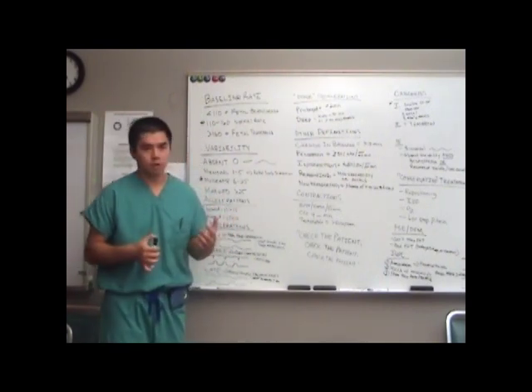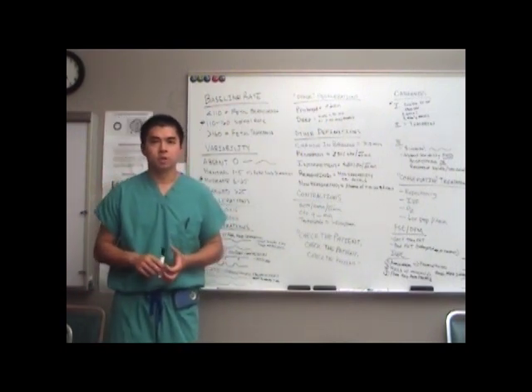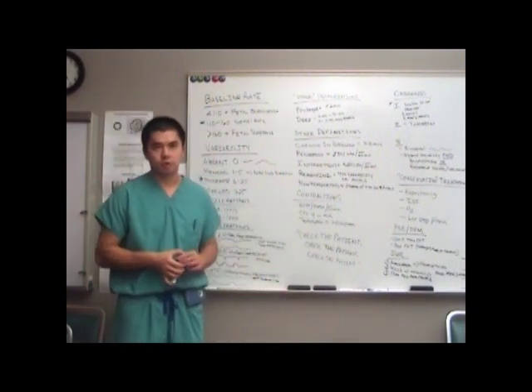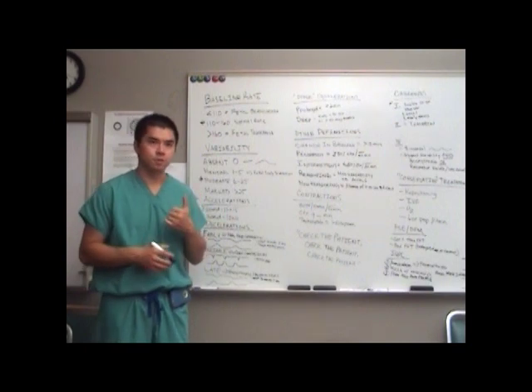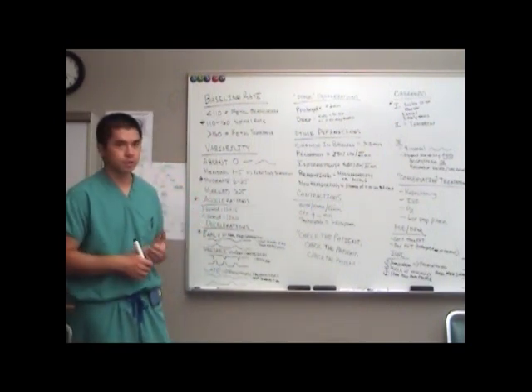It's also important to know how to describe fetal heart tracings to your listeners, and you want to give them an exact definition and err on the side of being more descriptive rather than going to categories, because your goal as the person describing the fetal heart tracing is to be able to describe it in a way that your listener can reproduce the exact image in their mind of what you're seeing.